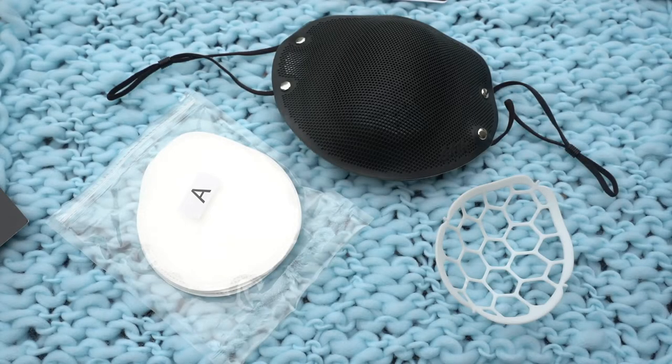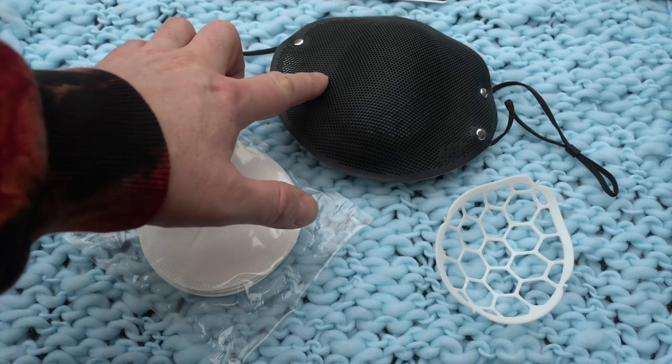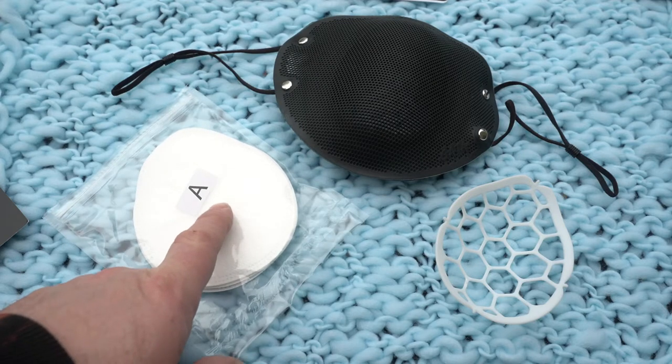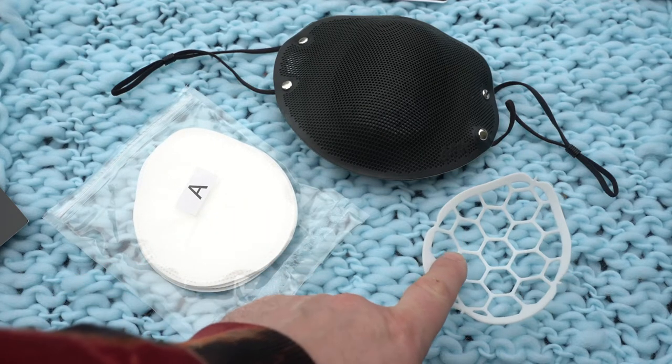This video describes how to put a filter into a GataMask. The GataMask comes with three parts: the silicon face seal portion, the disposable filter, and the filter frame.